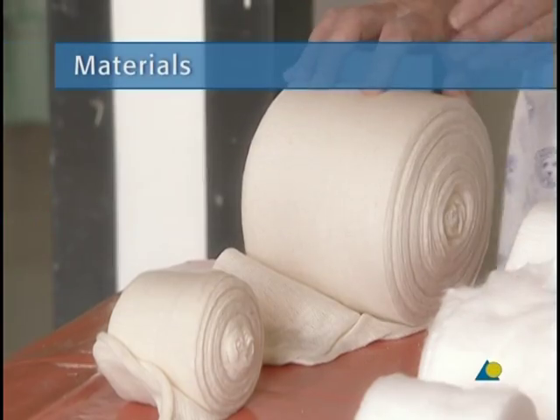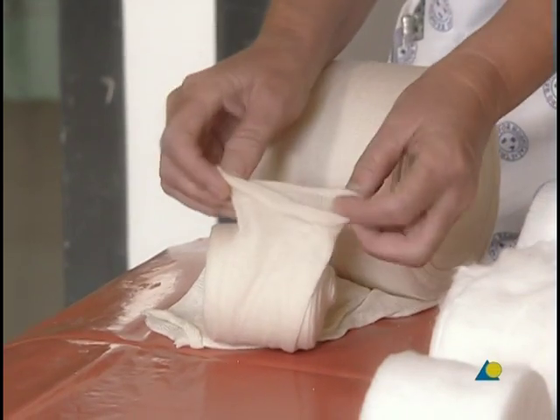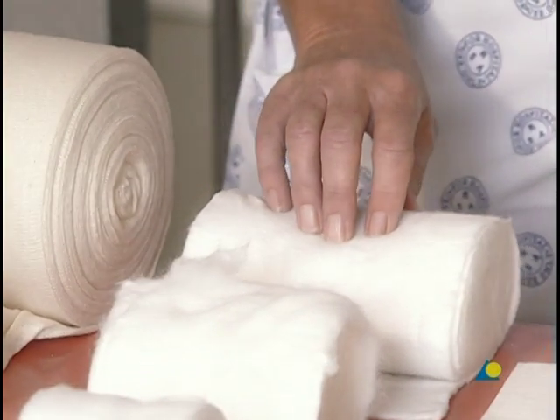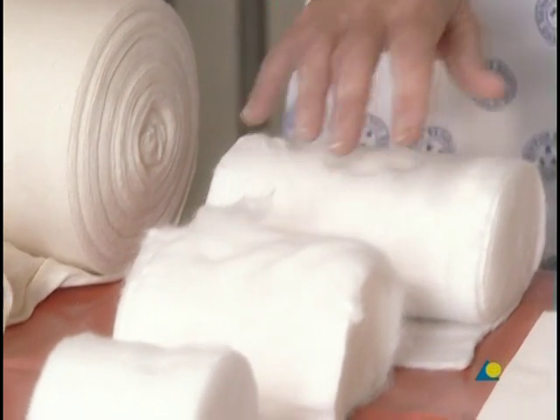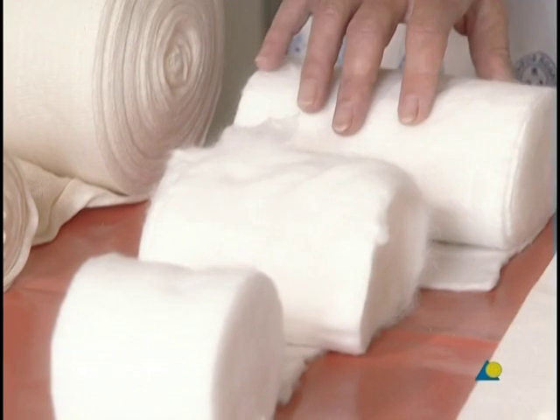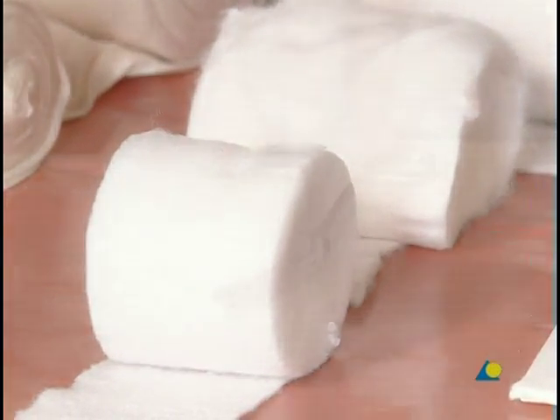To apply the volar slab, the following materials are needed: a stockinette or tubular gauze bandage; cotton wool 100 millimeters wide, used as undercast padding. For children, a width of 75 millimeters is sufficient. Scissors are also required.